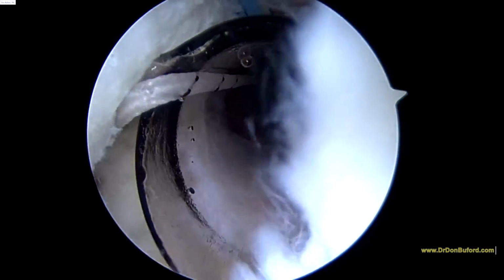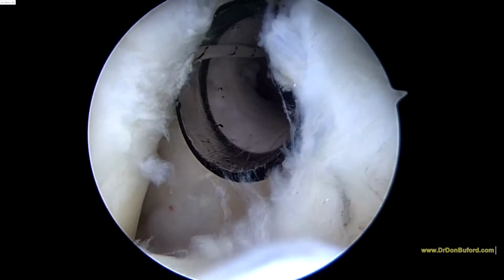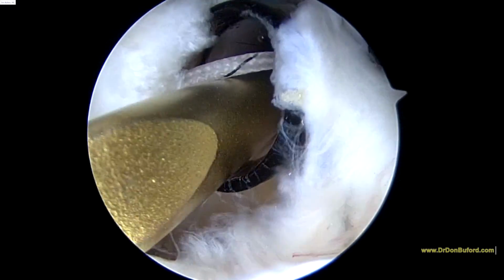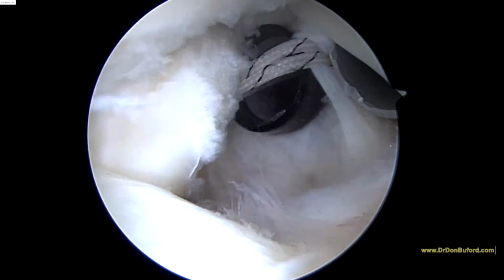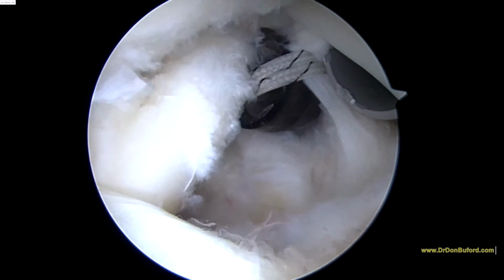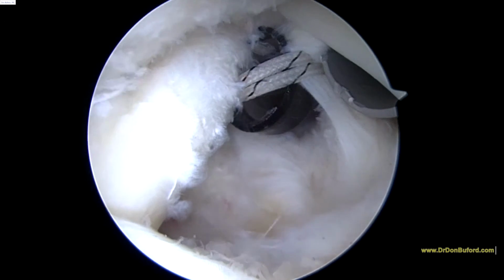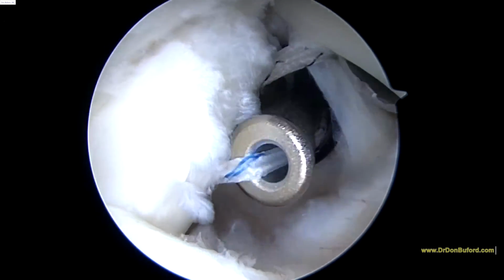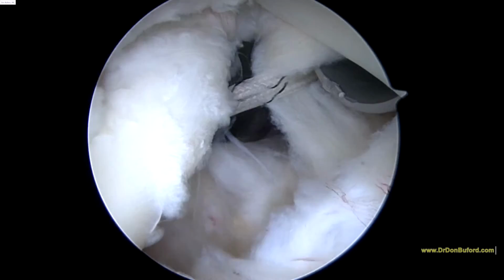That suture is coming right through the edge of the subscap there. So now we're going to get the partner black and white suture, and then we'll pass another stitch. Okay, we're just getting ready to tie down these two sutures. Looks like that one's the one coming through the tendon, which is what we want.